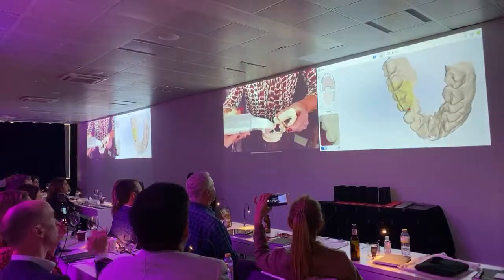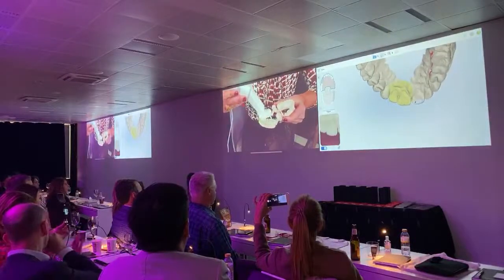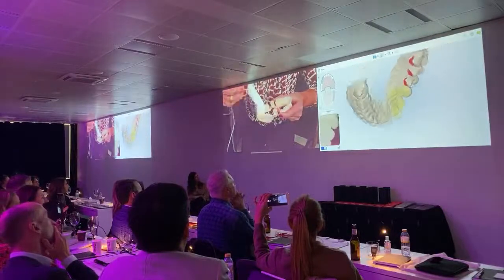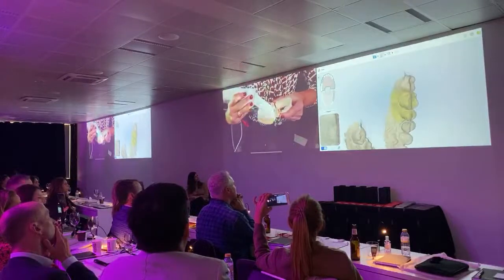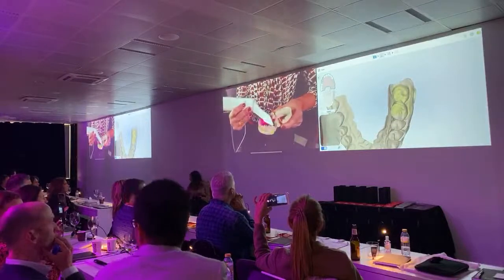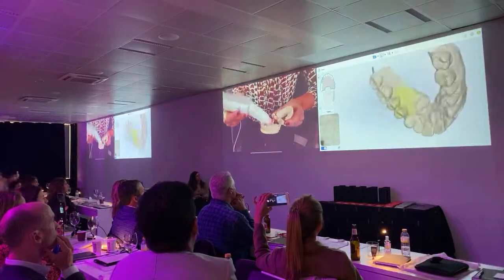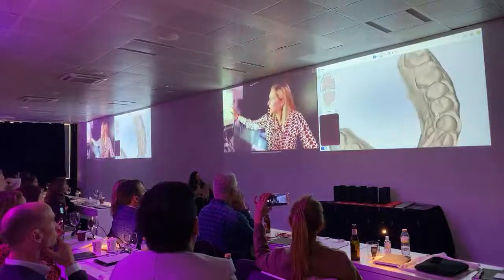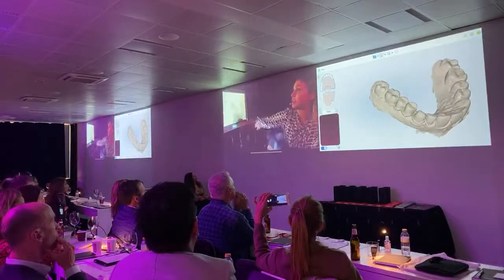When you are in the posterior area, your camera has to go horizontal. When you go anterior, you put the camera vertical. And then horizontal again, the wave movement. And then you copy the palatal. I don't have here in this model, but now is the time that you copy, okay? Perfect. So now this is one area that I need to check. Is the proximal? It's okay. So now I'll go prep by prep.